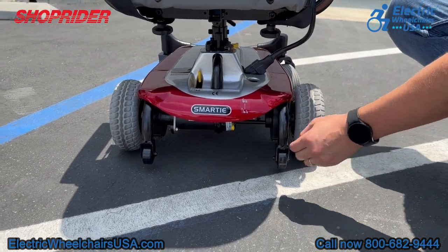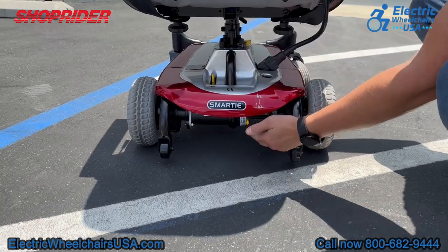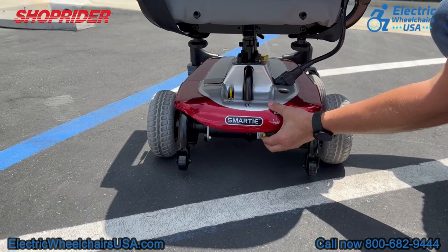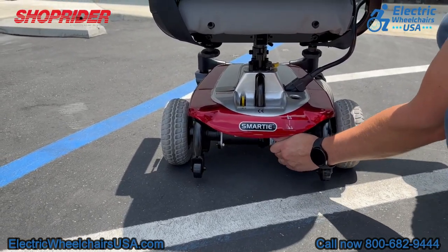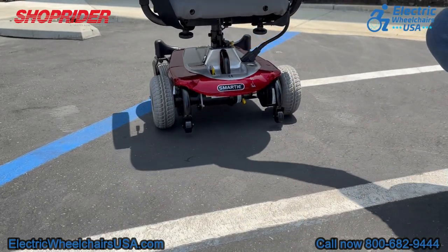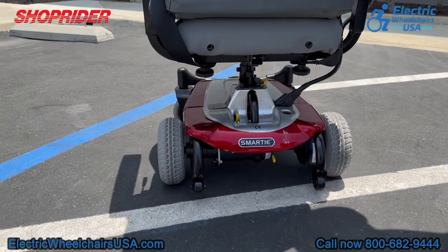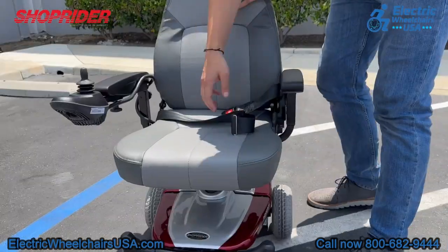These anti-tip wheels are here for added safety in case you go up a steep incline, ensuring you do not tip backwards. There are two yellow levers on this unit — one right here and one underneath. If you press both of them down, that puts the chair into freewheel mode, so you can push the chair like a manual wheelchair. Keep in mind that you cannot operate the chair in freewheel; you have to put both levers back in the up position.